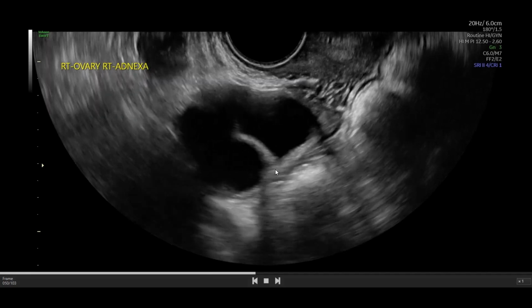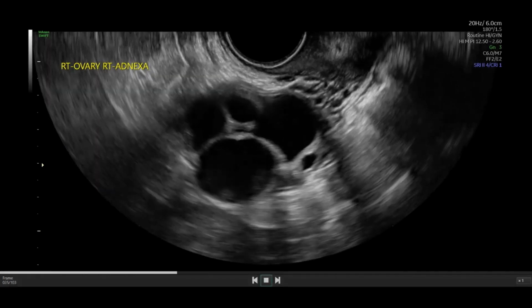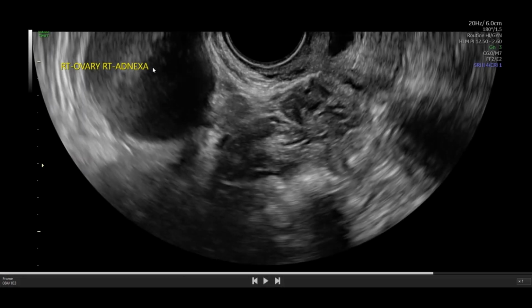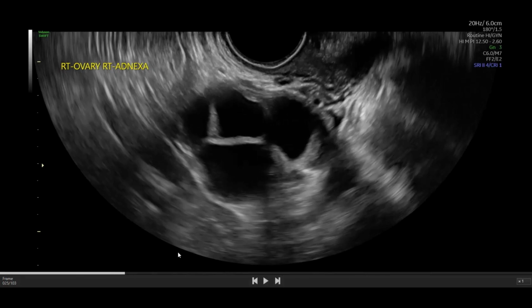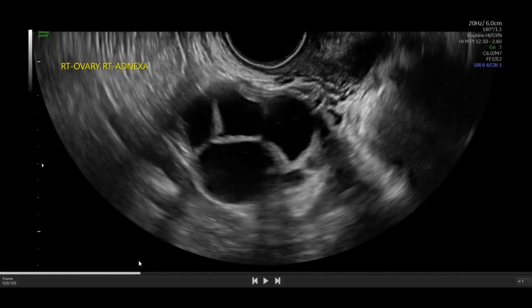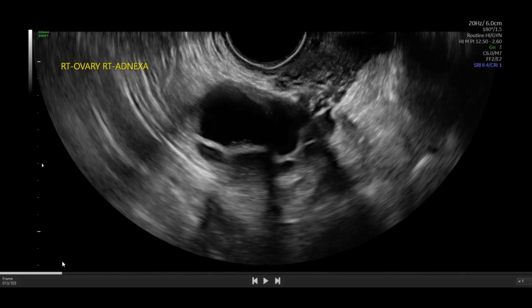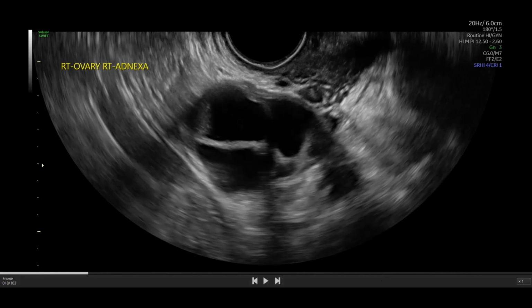So we've got the scan through it, and this is the first scan. And then at the end of that clip, and we'll stop again as usual, I'm also seeing another cystic lesion, top left here, right under the annotation, which looks distinct actually. So there's this, and then there's this. There's that, and then that, and then that. Two things. So we're going to actually go through both of those and try to understand what each of them is, and be as detailed as possible in the characterization.